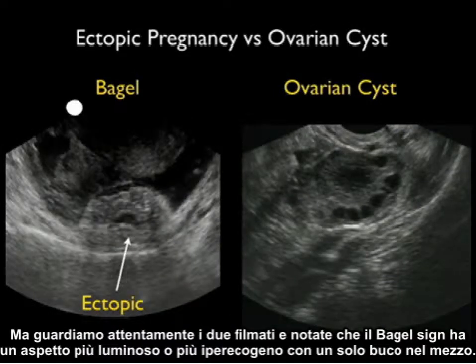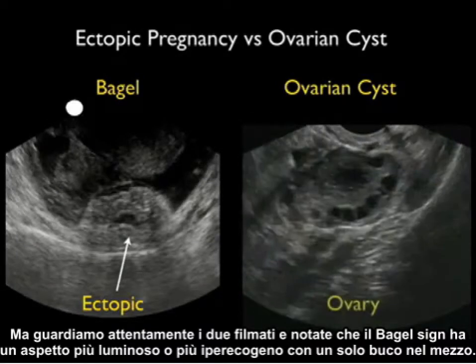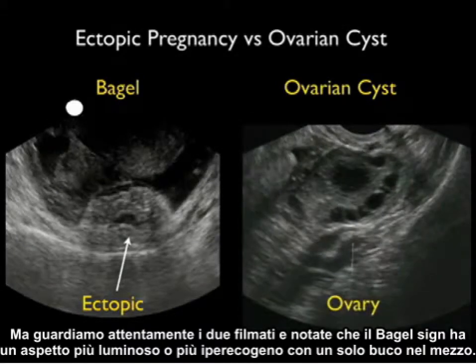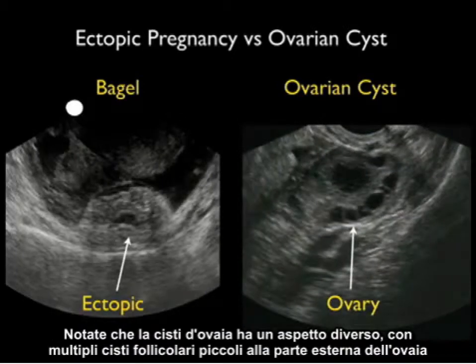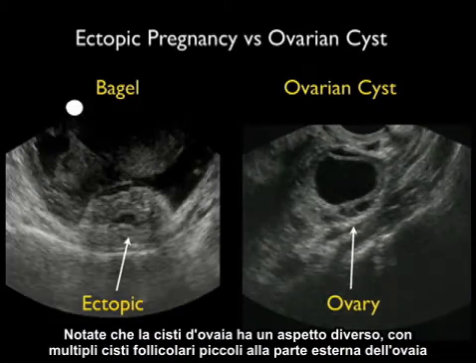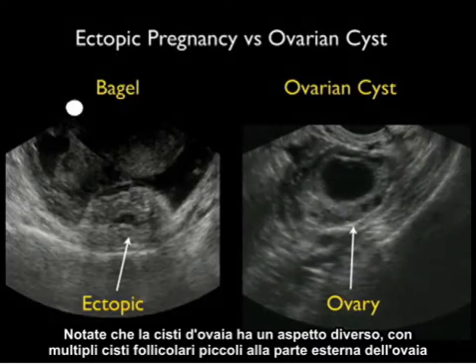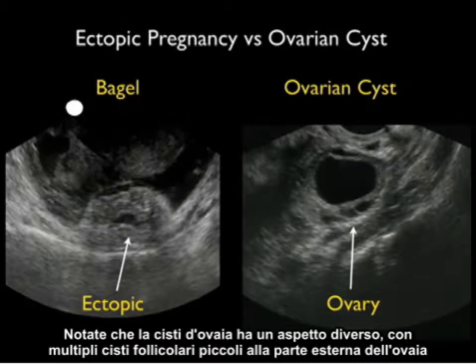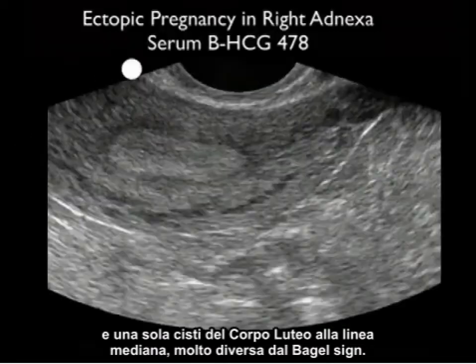Looking closer at the two video clips, notice that the bagel sign has a more hyperechoic or brighter appearance with a single hole in the middle. The ovarian cyst has a different appearance, with multiple small follicular cysts to the outer portion of the ovary and a single midline corpus luteum cyst — very different than the bagel sign.